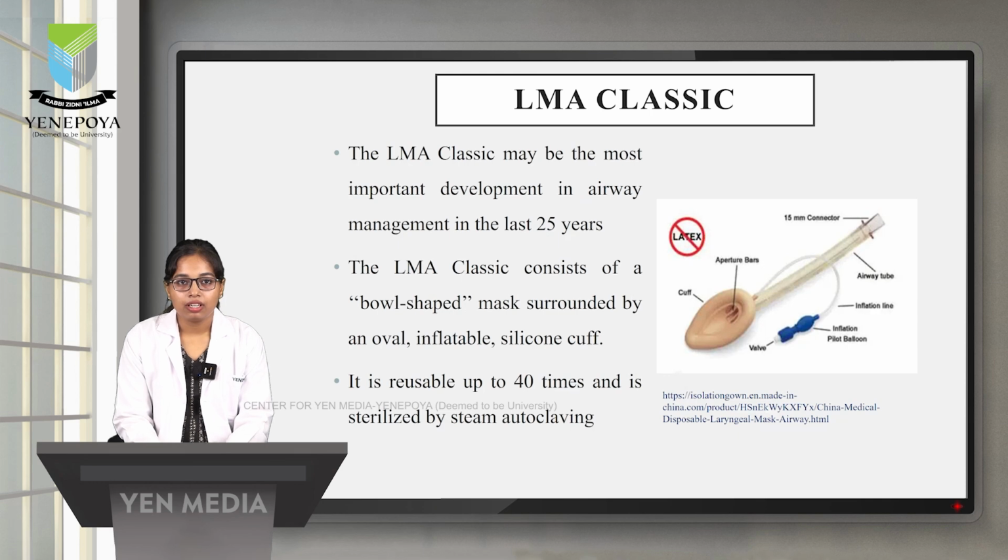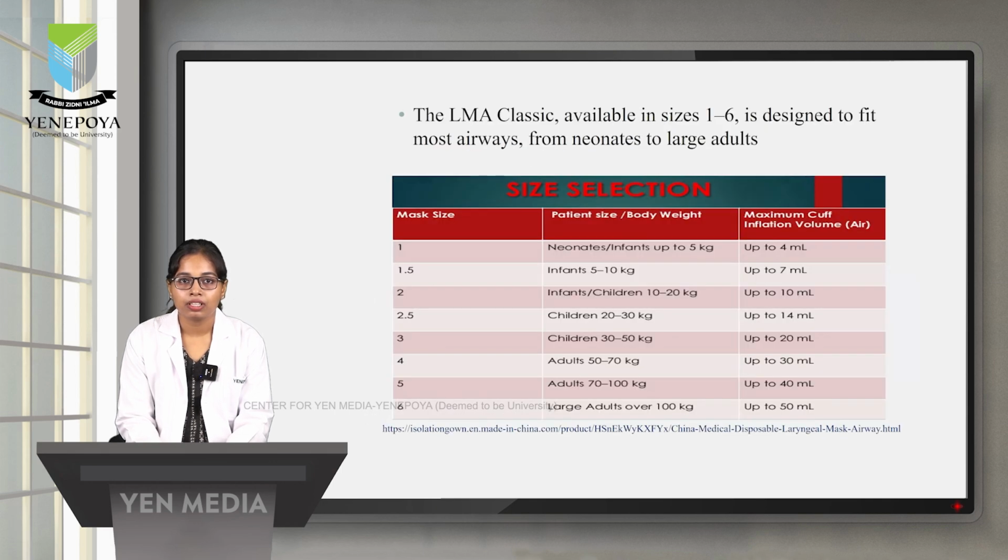LMA Classic may be the most important development in airway management in the last 25 years. LMA Classic consists of a bowl-shaped mask surrounded by an oval inflatable silicone cuff. It is usable up to 40 times and is sterilized by steam autoclaving.